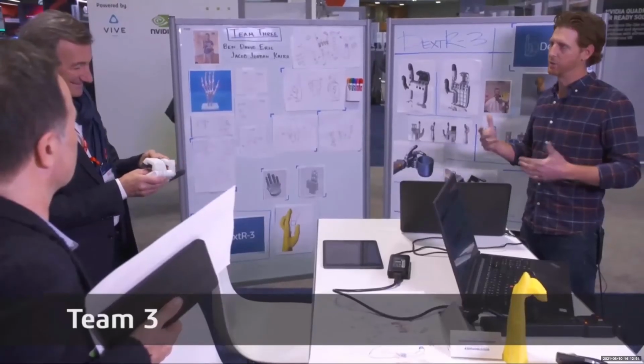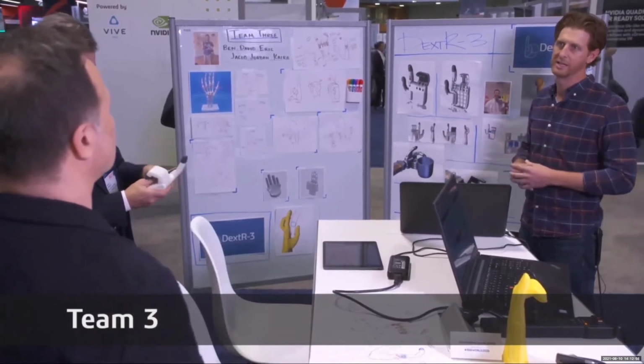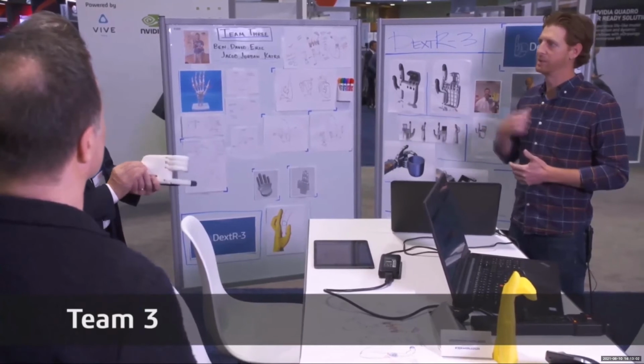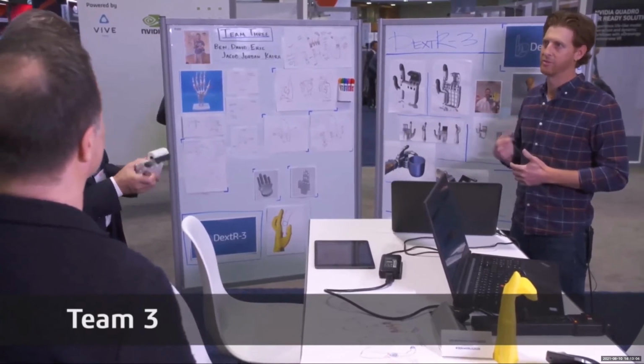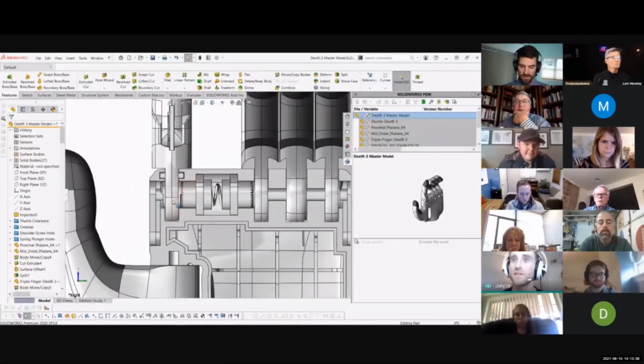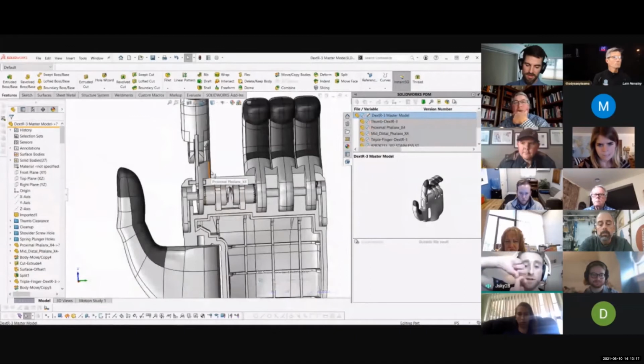And so that's why, in general, we believe that the Dexter 3 strikes a healthy balance between functionality, simplicity in manufacturing, and that ability to bring a human connection back to the life of those who have lacked it. This is using a cam gear mechanism. So all you have to do is push sideways on the button. It releases this cam, releases the gear, and allows the finger to then spring back up into position.